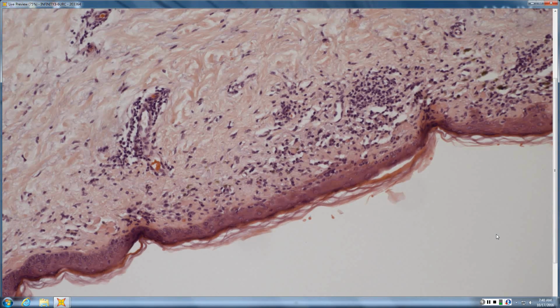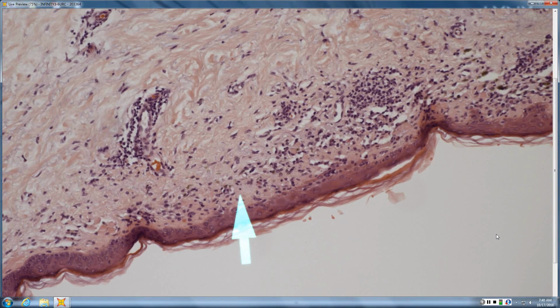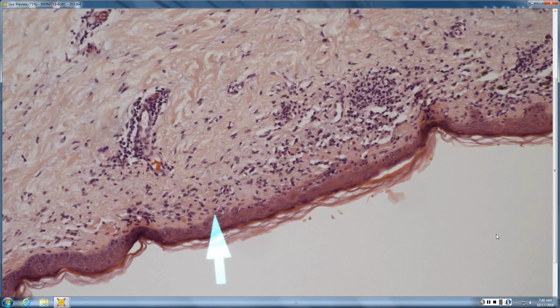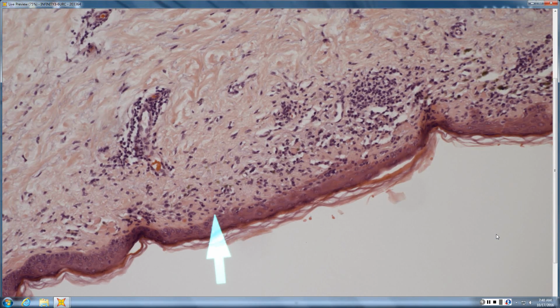So how fixed drug would be different potentially: you'd expect papillary dermal fibrosis, usually no Civatte bodies, but papillary dermal fibrosis. Your pigment would be down around vessels, and your basal layer would not be, you wouldn't have the squamatization. So squamatization, Civatte bodies, pigment that's higher, hasn't gone down around vessels, sort of burnt out lichenoid dermatitis. So late stage of lichen planus, benign lichenoid keratosis, anything lichenoid in its burnt out phase.